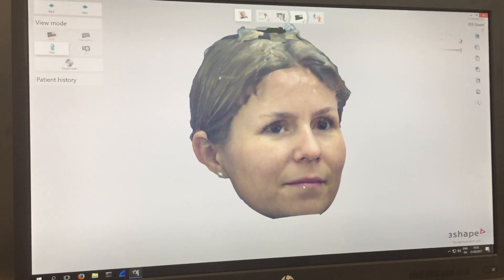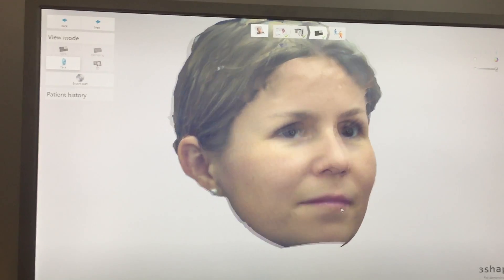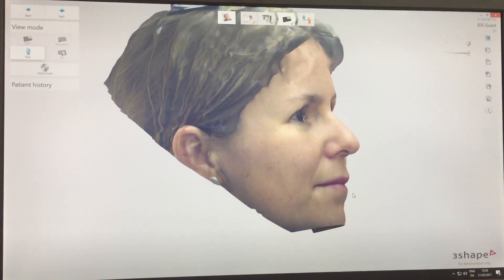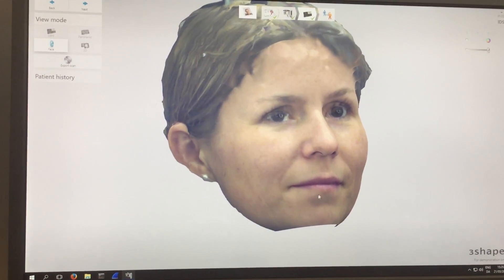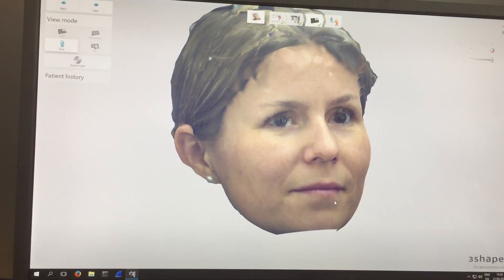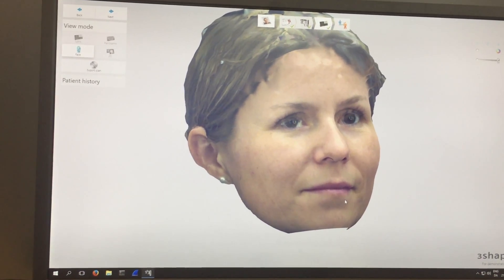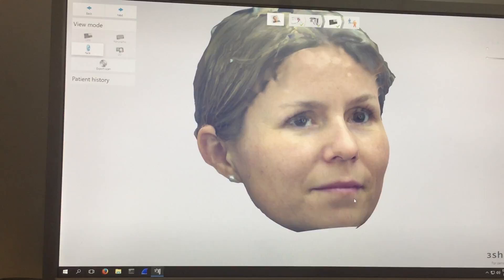So here we have the face scan. And the face scan could later be used for a smile design and stuff like that.